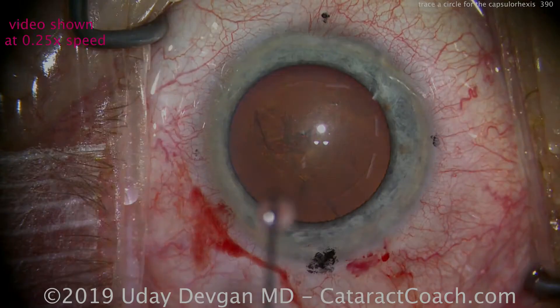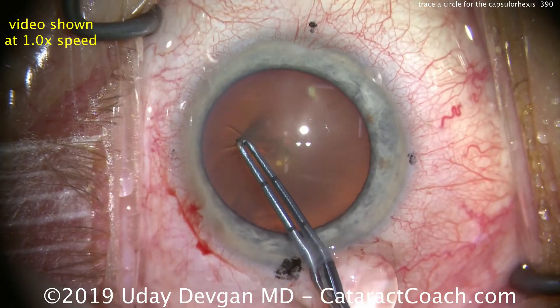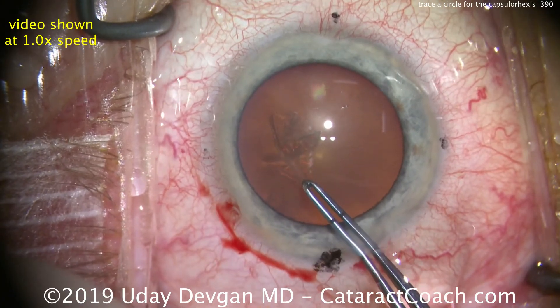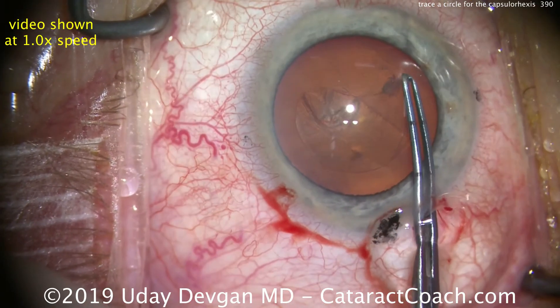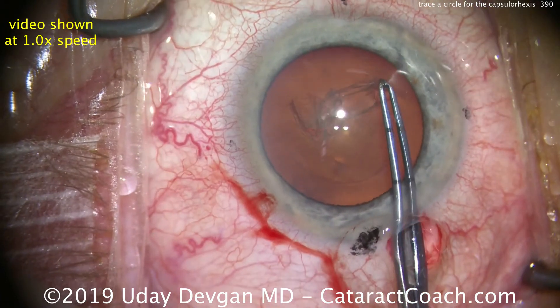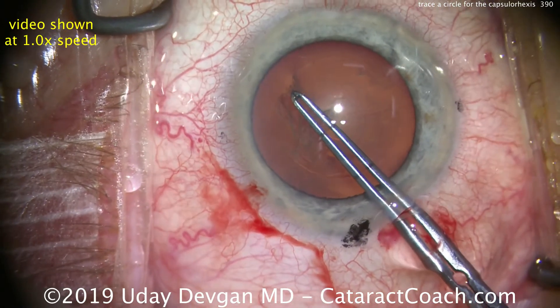Let's show again at regular speed. Back to normal speed — measuring, poking with the forceps, grabbing the anterior capsular tissue, and here we go. The tips go in a perfect circle. Grabbing the tissue, look at the path of the tip — it's a circle. One more grab, and look at the path of the tip of the forceps. The tip traces a path equivalent to the rhexis.